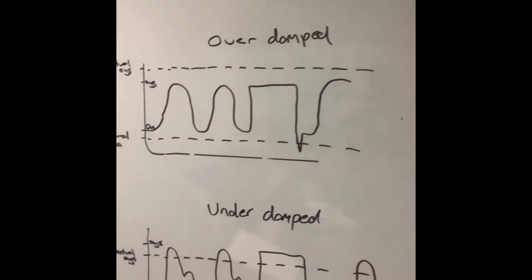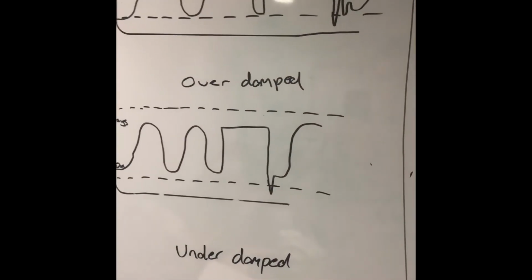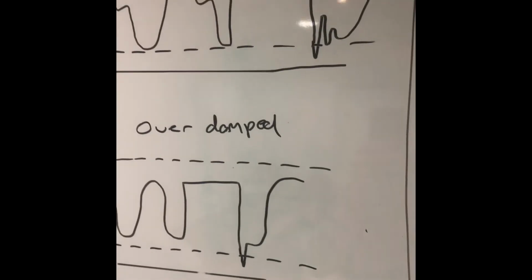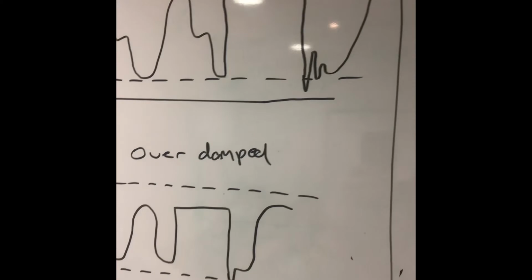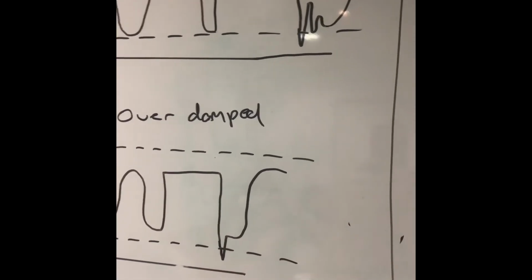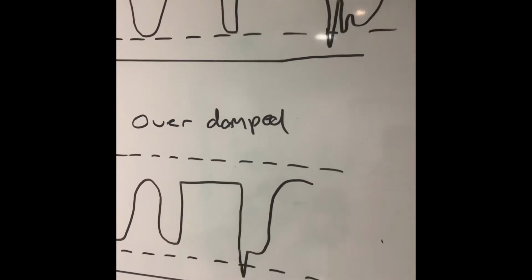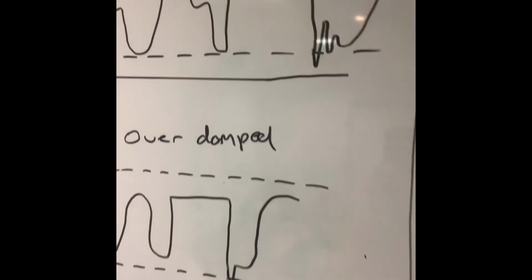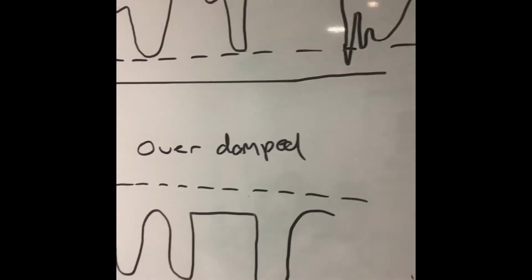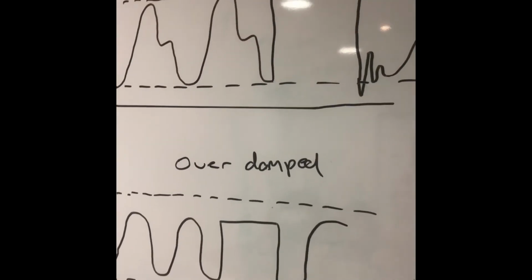All right, now the square wave test. Here are some more rough renderings of some variations of the square wave test. Now, this test is to test the damping in the line. Damping is the pressure exerted on the diaphragm of the pressure transducer. This test involves a rapid flush while monitoring the projected wave. This funny looking thing here. Projected wave to determine the accuracy of the pressure transducer.